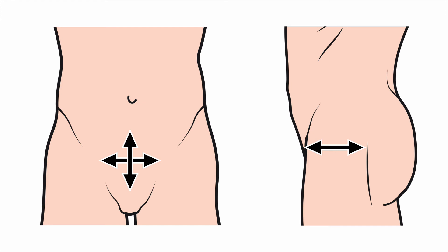In this example, we're measuring cranial to caudal and lateral to lateral on the left image, and anterior to posterior on the right. We could easily do lateral to lateral on the left image and anterior to posterior and cranial to caudal on the right image. Just make sure you are measuring all three measurements separately and not duplicating one measurement in two different planes.